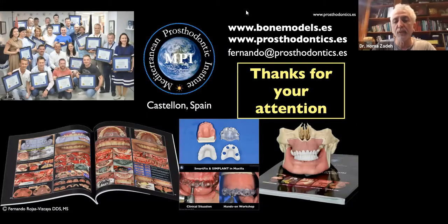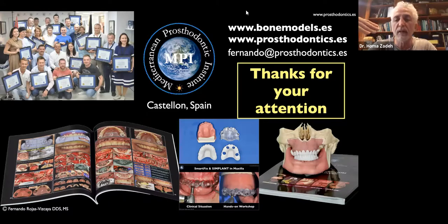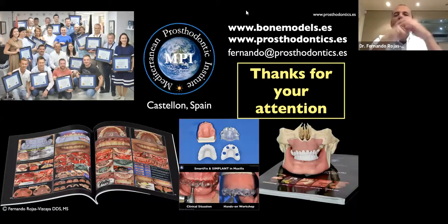So in that case where you only replace the teeth without any kind of pink ceramic, you design the pontics as scalloped pontics with an ovate pontic design. Where you make pink ceramic for the base, do you make that flat, or do you also make them ovate pontic? I make a convex, all around convex. So it's more or less the same principle.